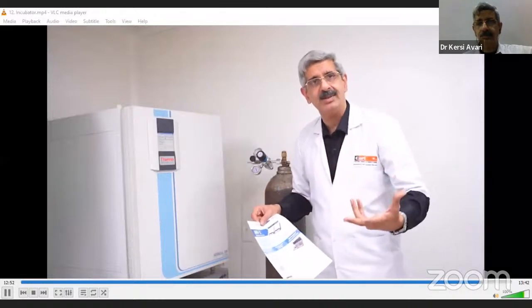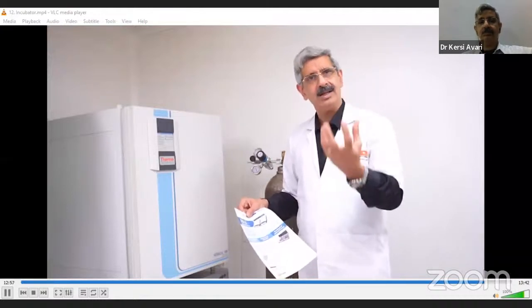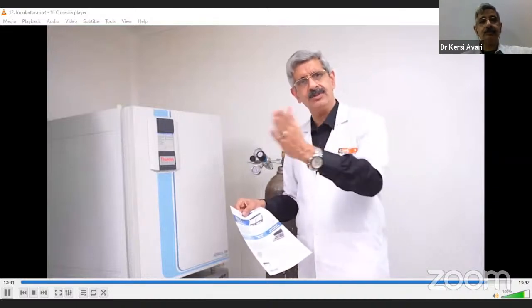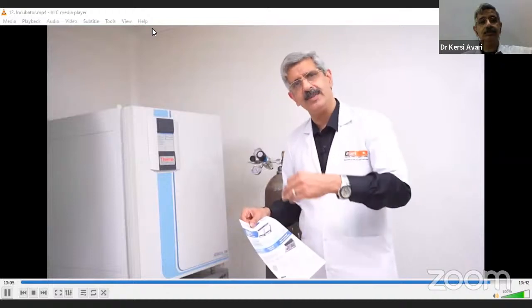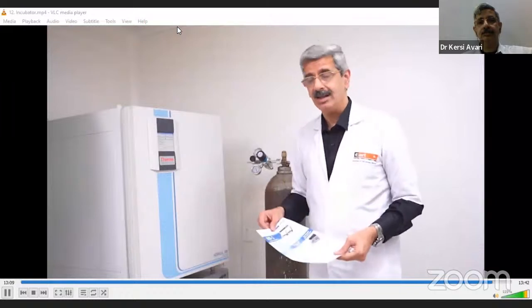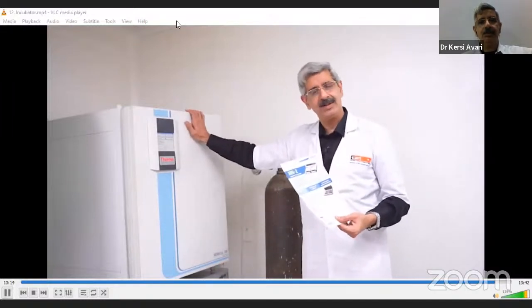Because now with the concept of single step media coming in, you have to just load the embryo in a culture dish, a good amount of volume, keep it on day 3, observe it for a progression check or a blastocyst check on day 5, and then do the necessary. Options are available large, but still these box ones hold the key.